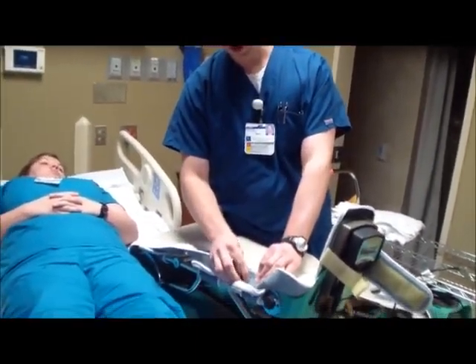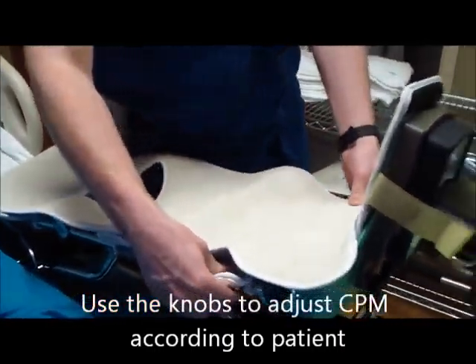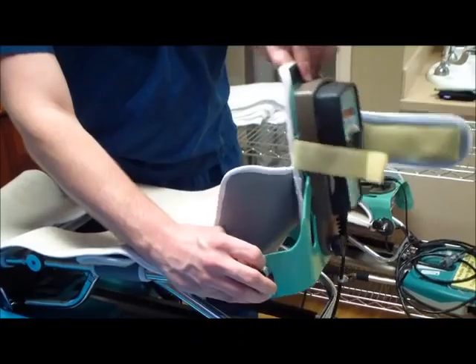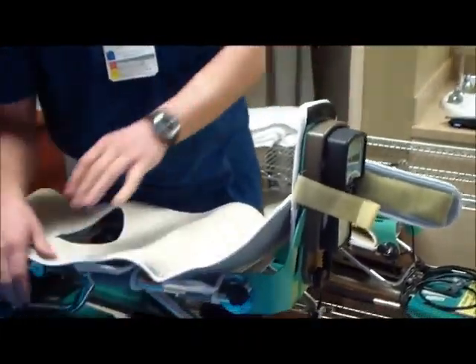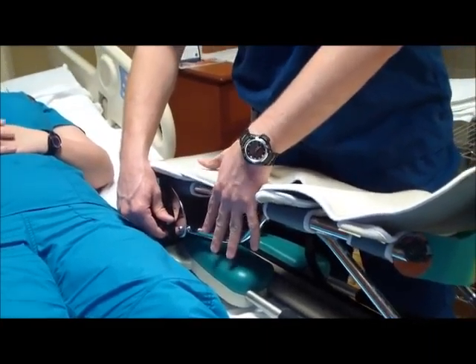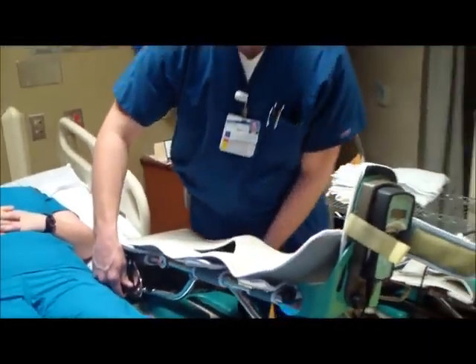So there's little knobs down here to adjust the length. There's knobs right here to adjust the foot part, as well as knobs right up here to also adjust different positions of the knee and length of the device.